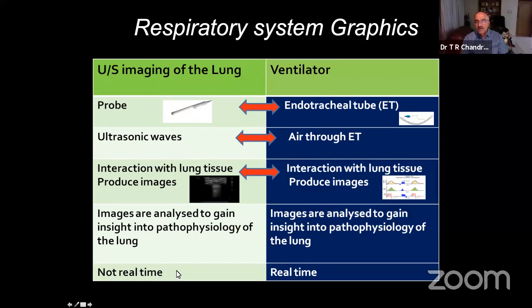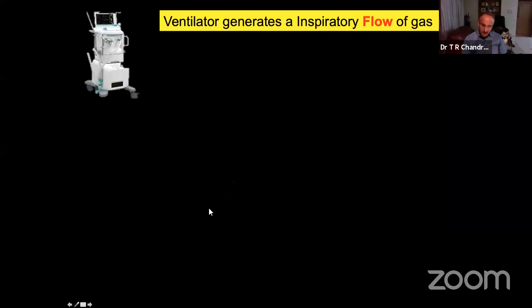You don't need to repeat a CT scan, or shift the patient. It is always on the ventilator. You just have to know what to look at, and you always get excited if you do an ultrasound. There is a lot more information that you can get out of the loops and scalars if you know what to look at. So yesterday we went through this, isn't it?